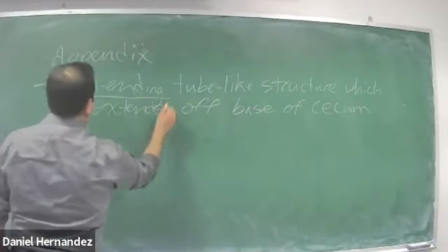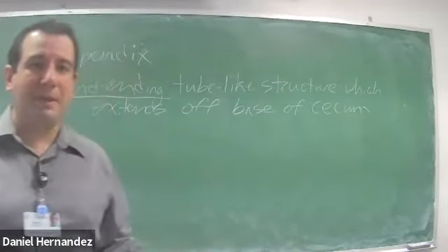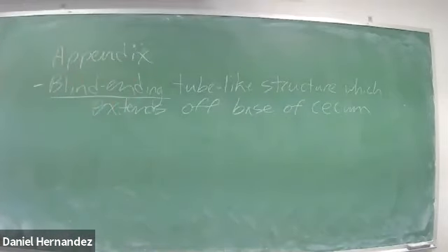Important is that term blind ending, because it's going to be up to us to prove that the structure that we're imaging truly is the appendix and truly is blind ending.